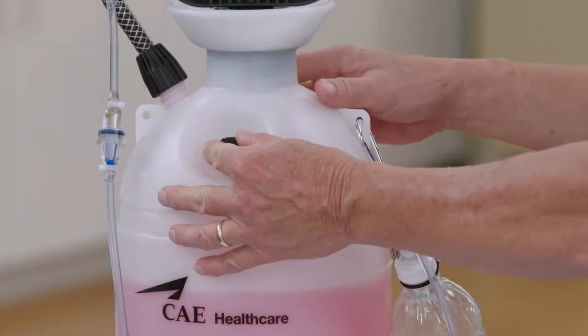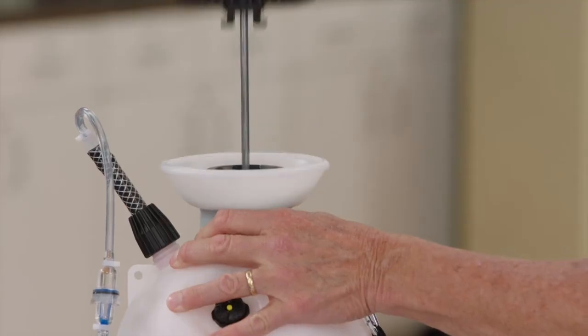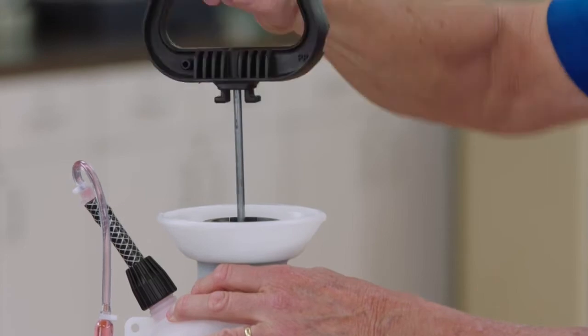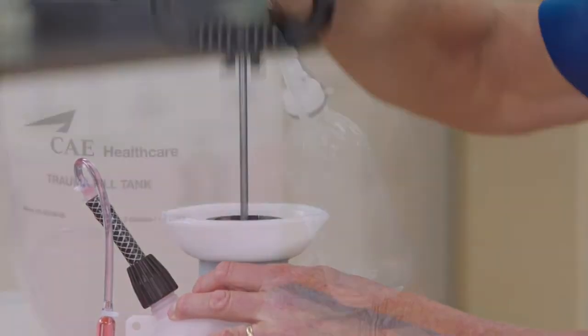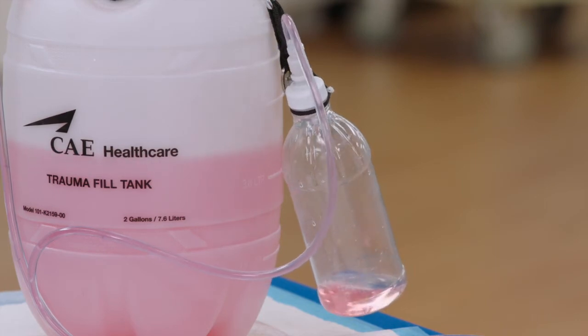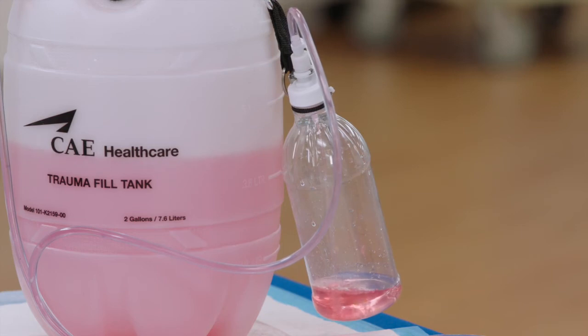Ensure the pressure relief knob on the trauma fill tank is closed, and pressurize the trauma fill tank by pumping no more than 20 times. Wait until there is a good return of fluid in the reclaim bottle — this may take a few minutes. A constant flow into the reclaim bottle indicates the blood tank is full.